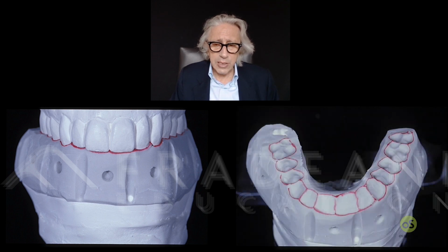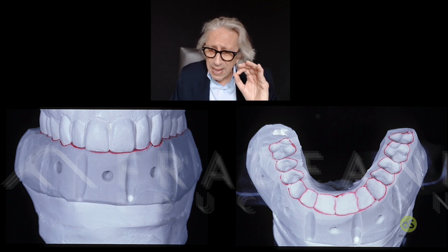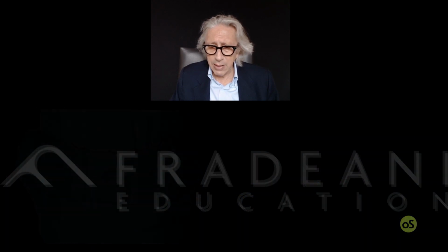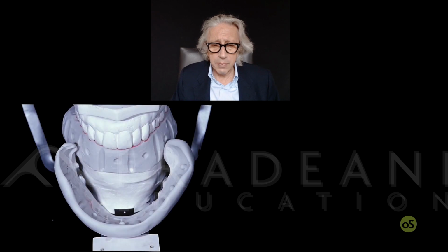Now we can copy all the positions of the mock-up, on the upper, the lower, on anteriors, on posteriors. You have the chance to use the silicone index again, derived from the wax-up and derived finally from the mock-up, which is practically the copy of the wax-up, with some light minor modifications we made, just minor. So that is the whole set that you can do in a crucial way, to copy exactly what you have done.